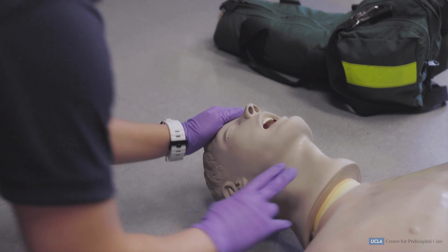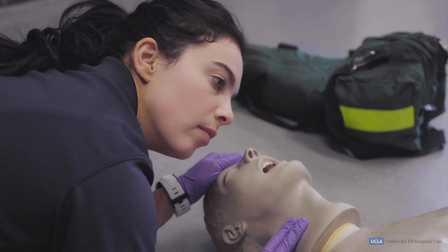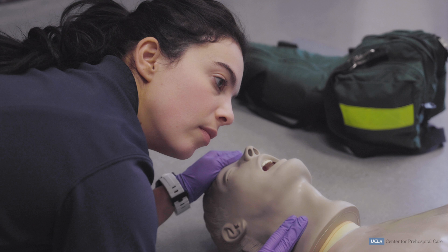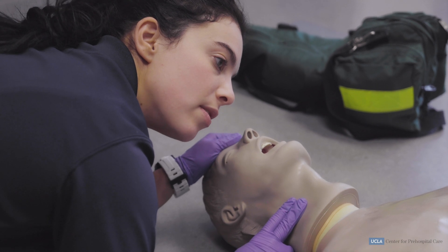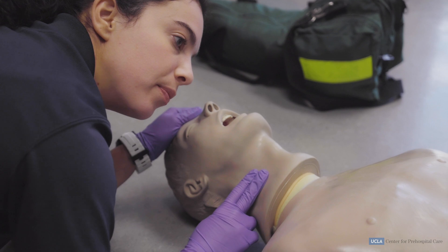Check pulse and breathing for at least 5 seconds, maximum of 10 seconds. To check for pulse, place your hand on the patient's carotid artery on the same side as you. I have a pulse rate of 60 beats per minute and the breathing appears to be absent.